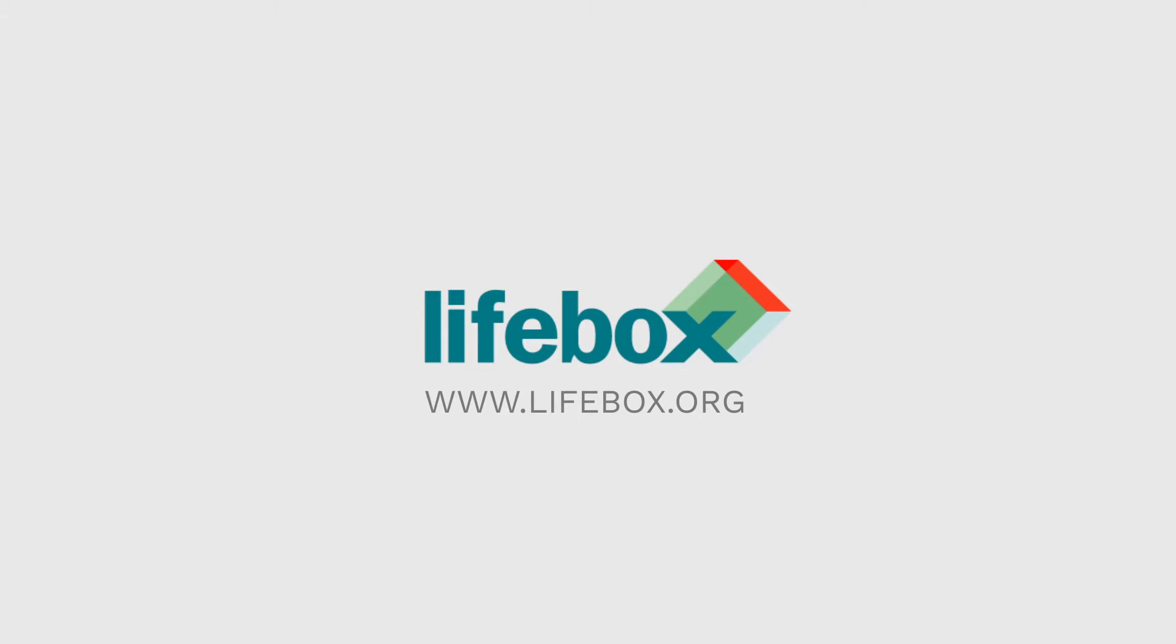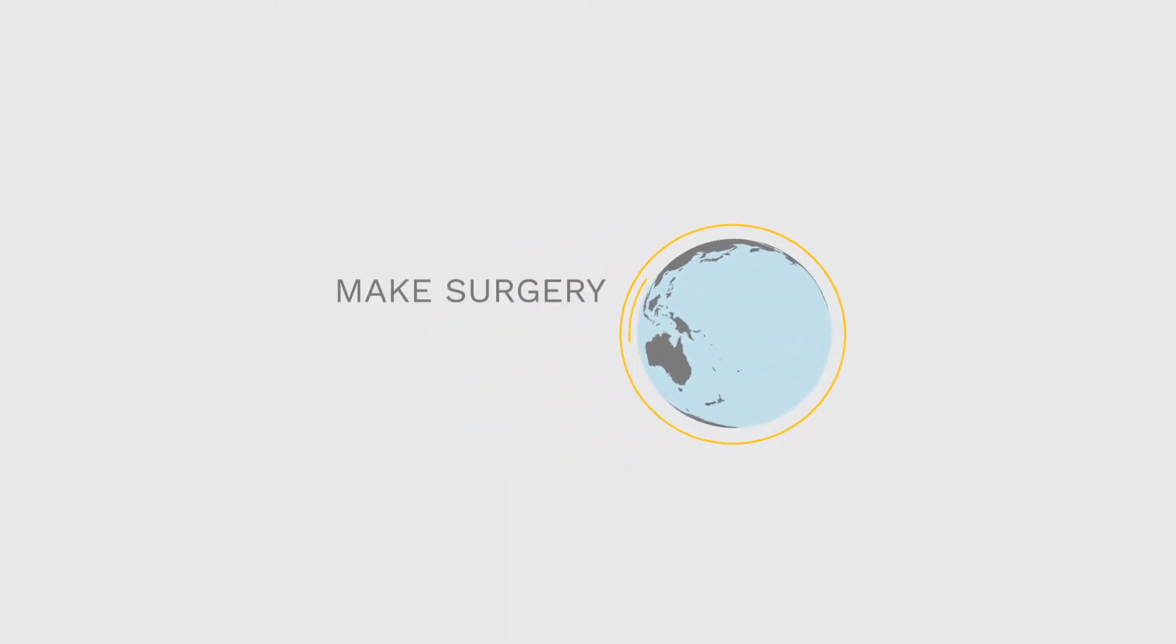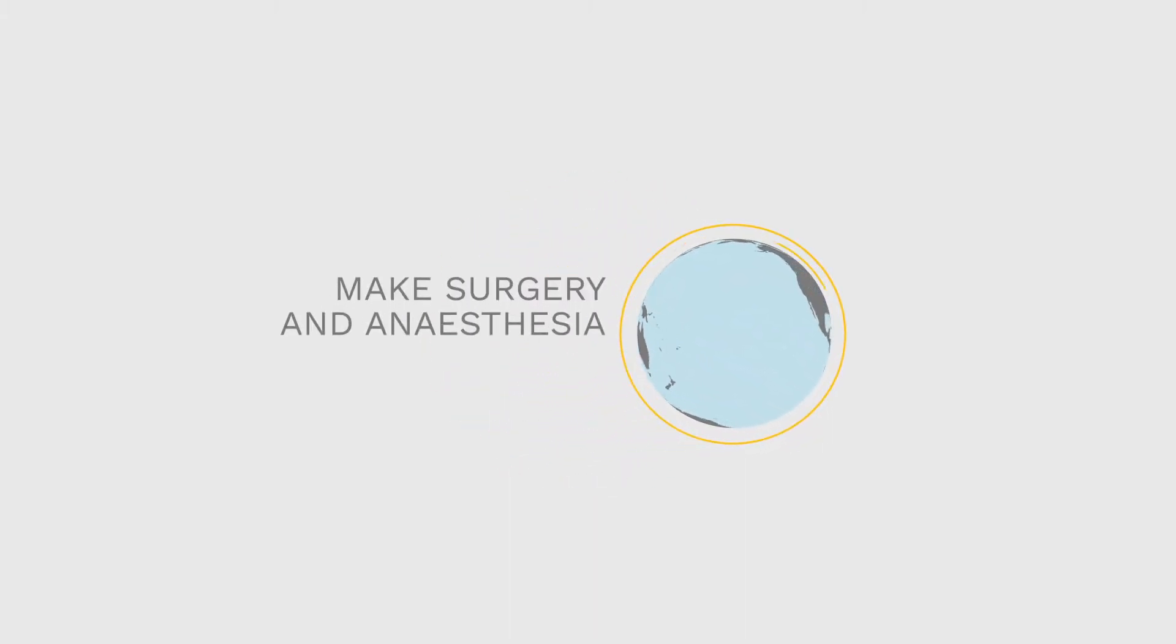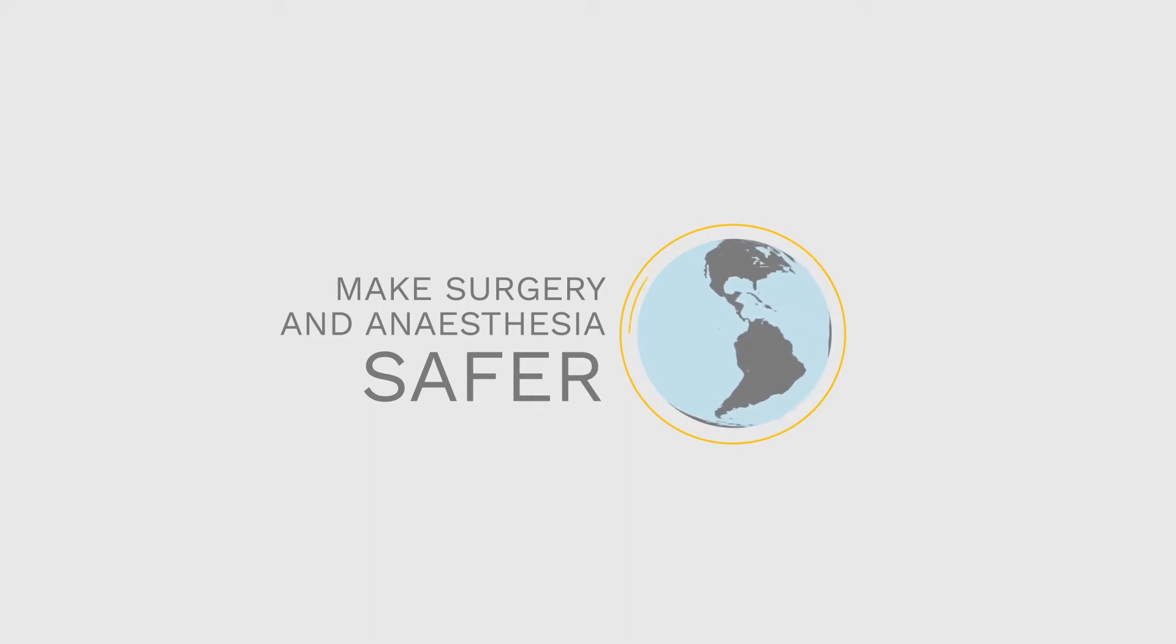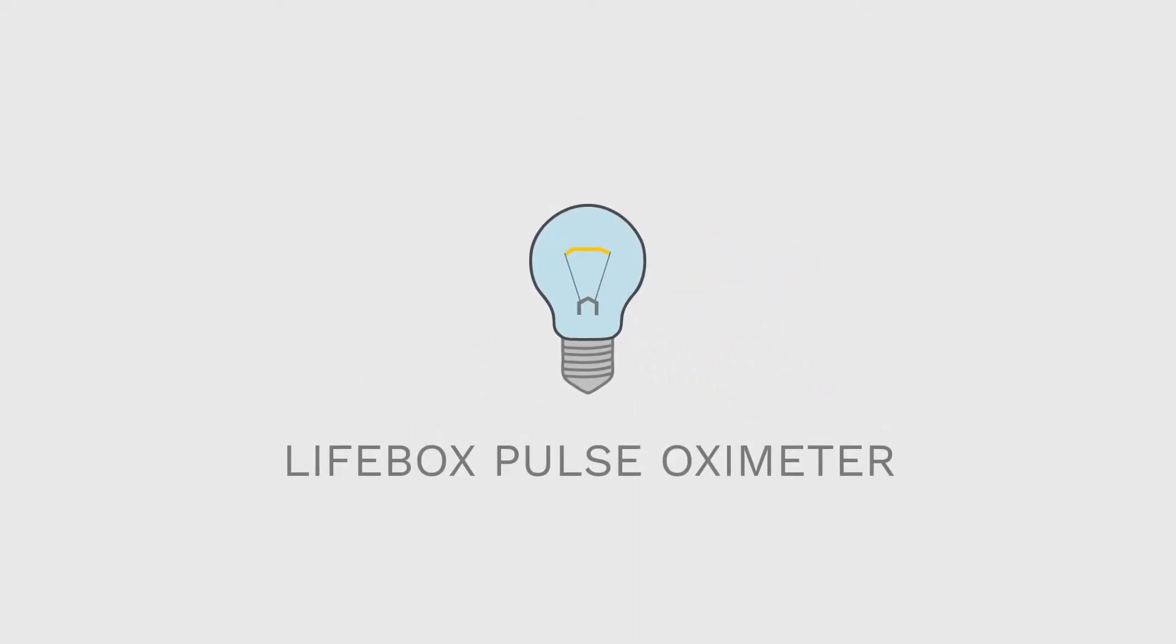Lifebox is an international NGO working around the world to make surgery and anaesthesia safer. In this video we're going to learn more about the Lifebox Pulse Oximeter.